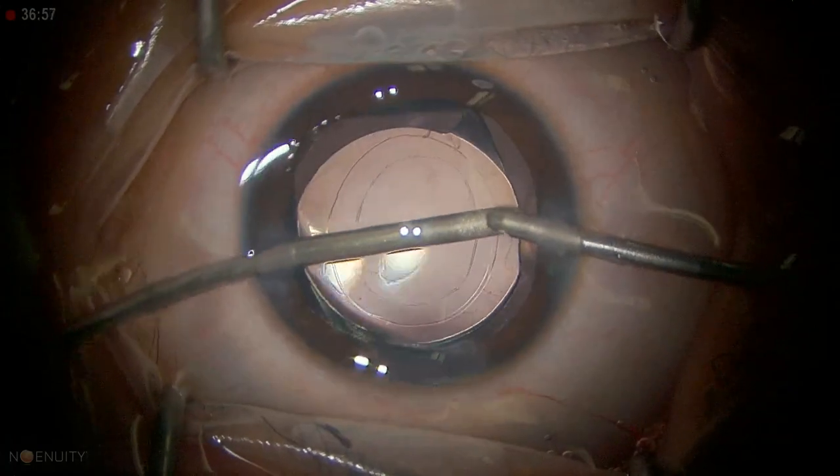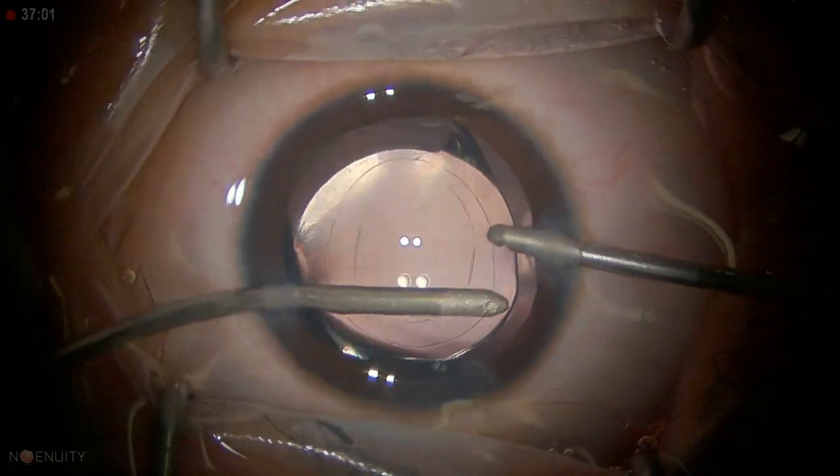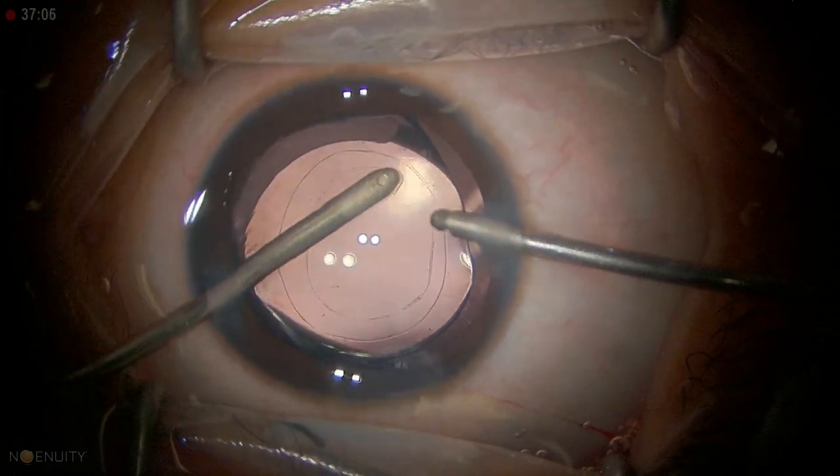I do a little bit of capsule polishing of the anterior capsule because a lot of epithelial cells proliferate from this area.